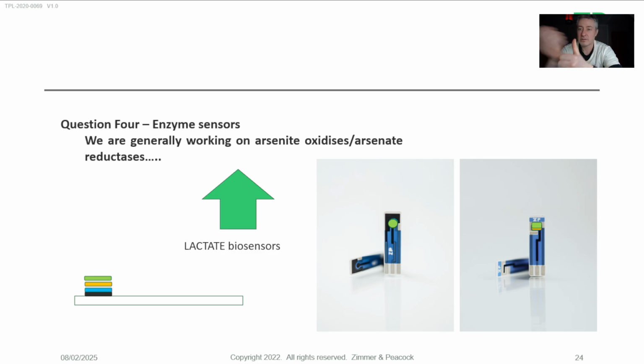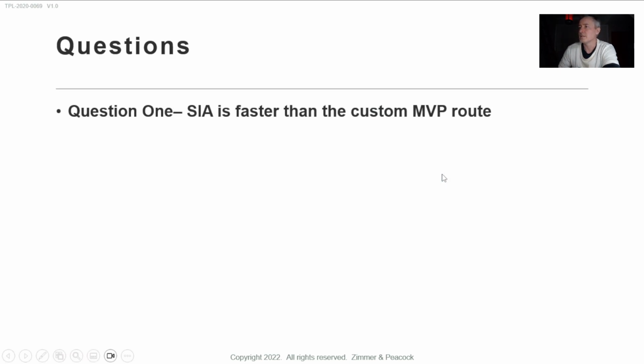So I think you need a carbon electrode. I would actually go for the Prussian blue catalytic layer. I would put an enzyme on, just deposit the enzyme by drop casting. I think lactate oxidase papers are a good place to find those formulations. If you find a good one, please tell me. And the barrier layer is a good idea. If you Google ZP, we have a polyurethane barrier layer that we use on glucose sensors, and that might be worth looking at.